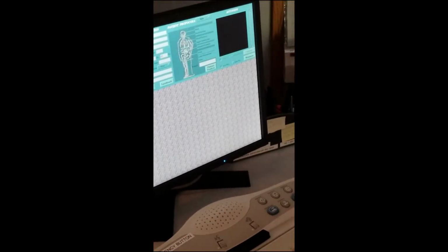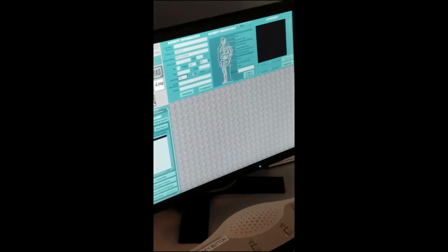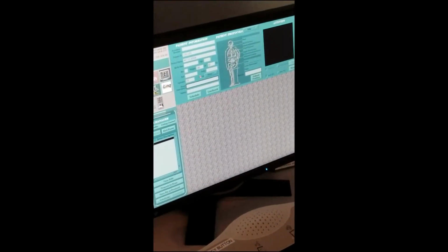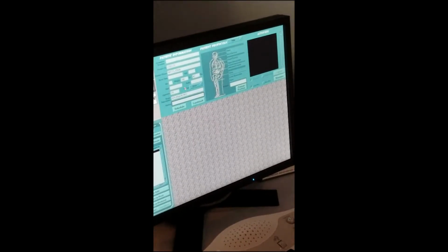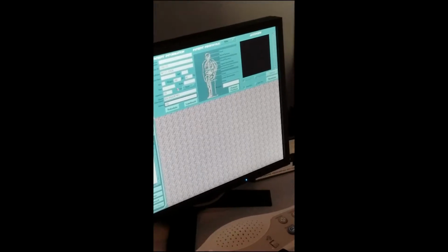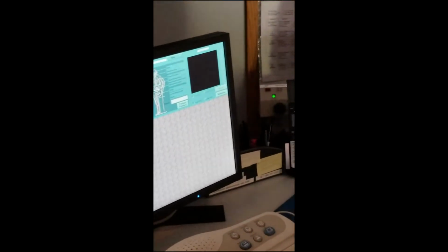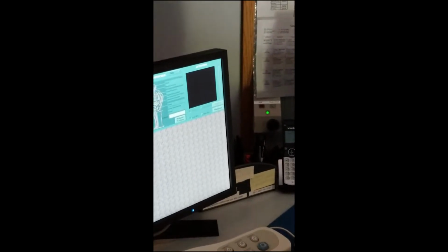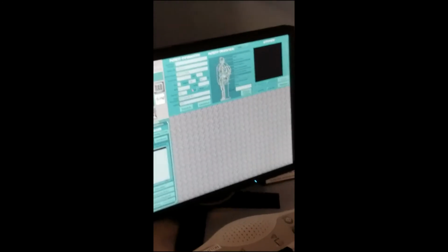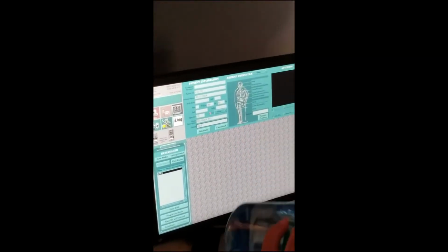Back up. So you need to put, operator is your initials. In a real world, everything needs to be filled, okay? And then you put MRI brain. Everything starts with an MR. You can't just say brain, left knee, right. Why? Let's learn something. Why is it necessary to put MR in the beginning? Because when it goes to PACS and a physician checks for the images, if they put brain, CT comes, PET comes, nuke med, whatever. But if you say MRI, then he goes straight to the MRI.